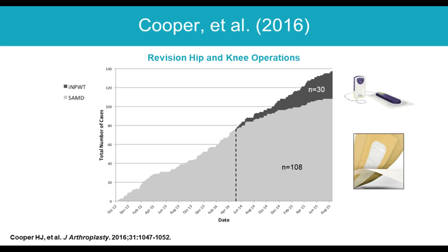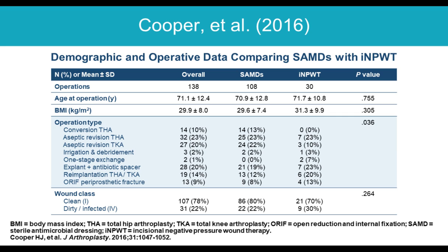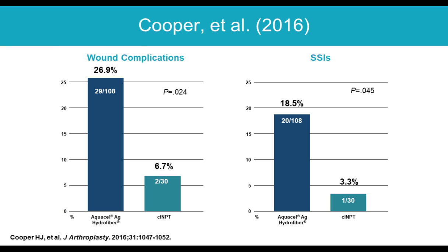So I was using them very selectively in the highest risk patients that I was most worried about, and still treating most of my patients with the standard dressings initially. When we looked at baseline demographics, there was clearly a difference in that, indeed, I was using the negative pressure dressings in the high-risk group, and my standard dressings overall had a lower risk profile in the kinds of surgery they were getting.